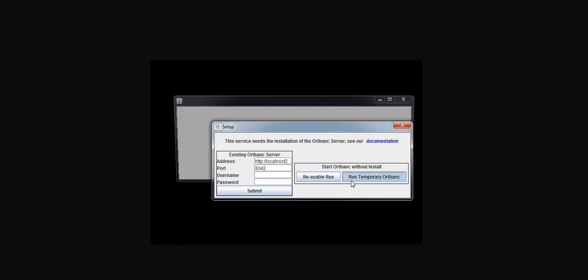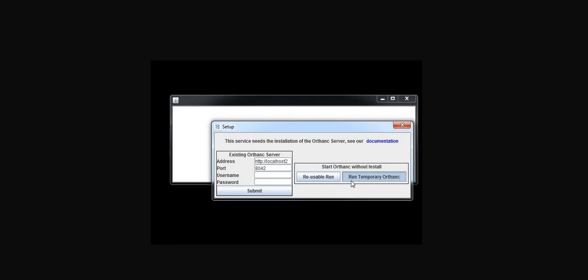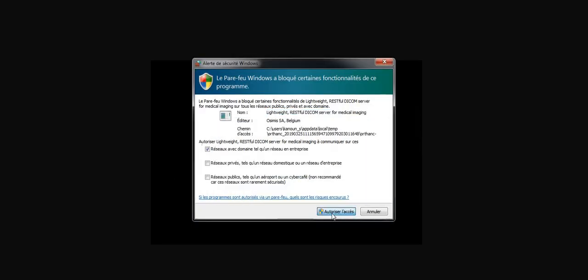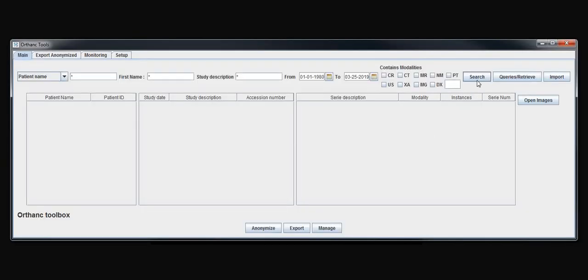I just have to press run temporary Orthanc. It is going to deploy Orthanc tools and then the application is going to start. I have just to put the correct address, localhost the default address, and then I have my connection of Orthanc tools which is a purely temporary session.